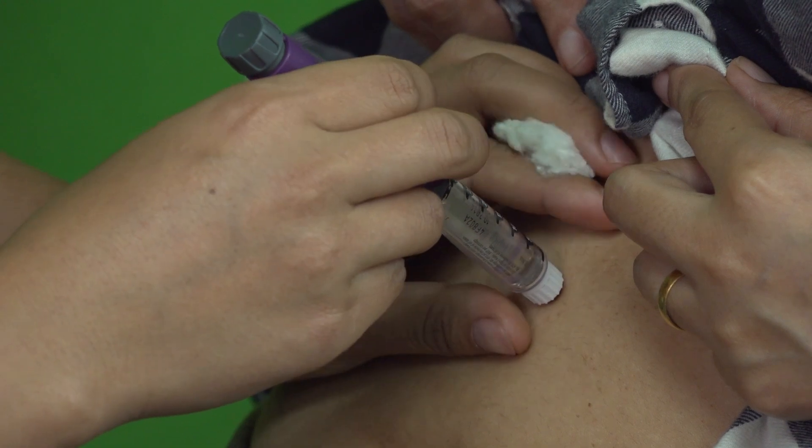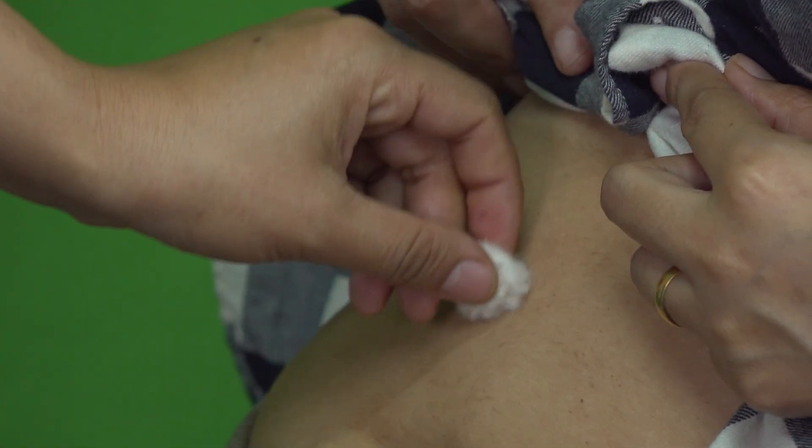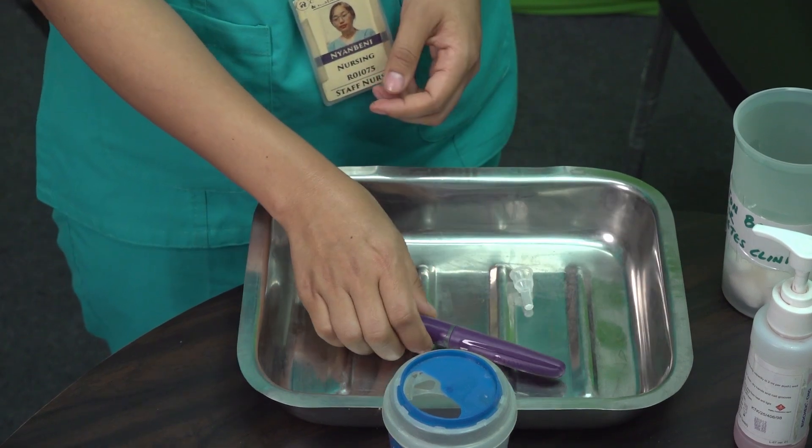Withdraw the needle at a 90-degree angle without rubbing or massaging the site. Properly dispose of the used needle and pen in a designated sharps container.